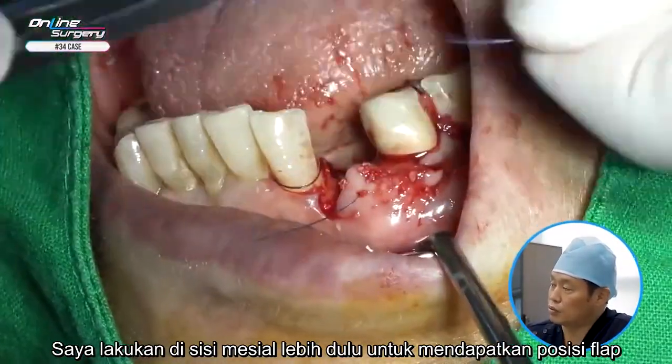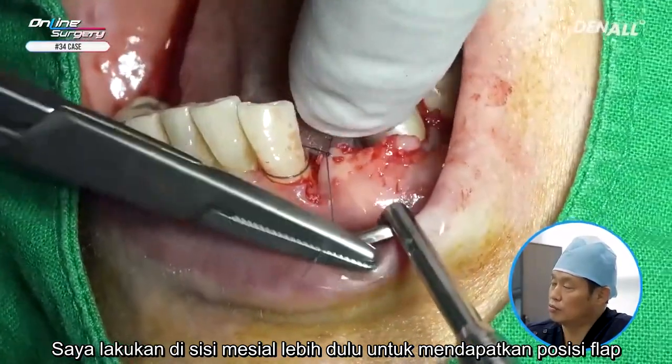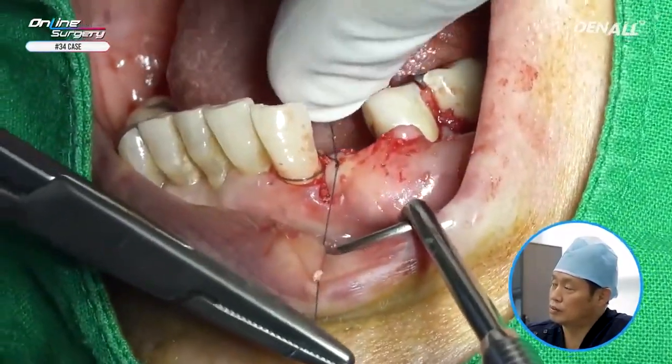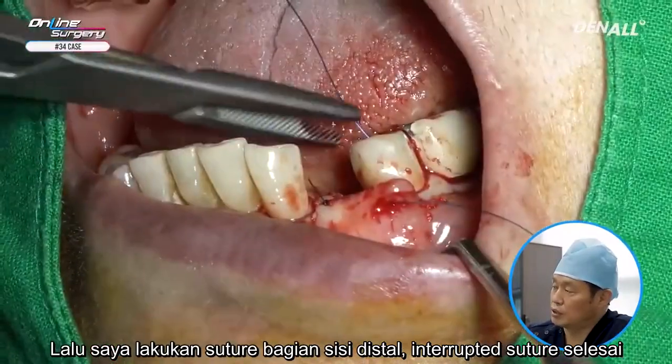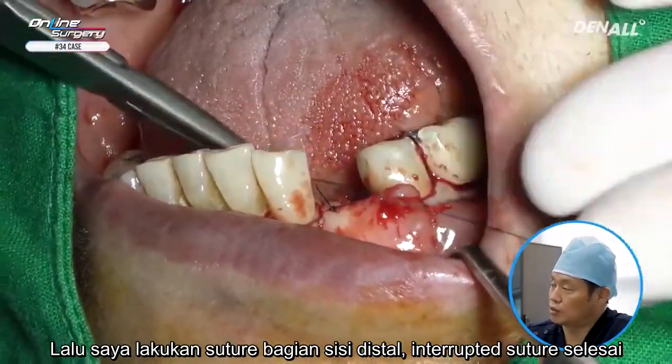I'm going to do the mesial side first to get the position of the flap. And then I'm going to suture the distal side. Interrupted suture is done.